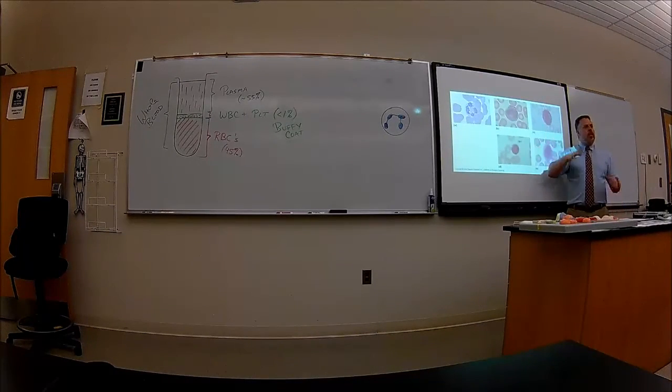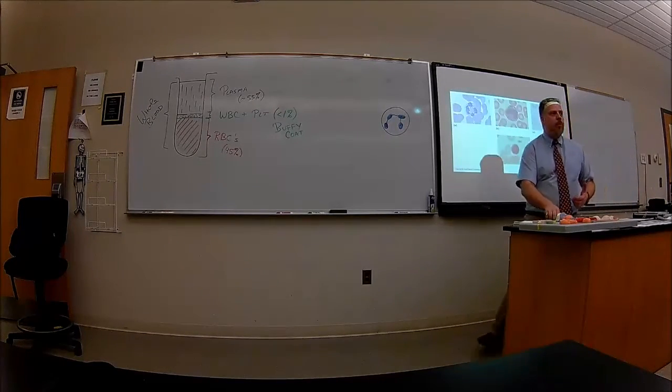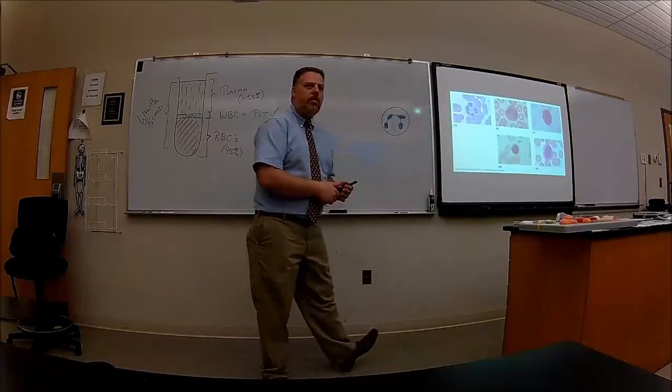Okay. Now let's just go through the motions. I know you use process of elimination. You did this already. But let's look at this one here. Is the nucleus lobed? No. It's not the best one. I would give you something different. But is the nucleus U-shaped, kidney-shaped, or is it filling up most of the cell? Kind of kidney-shaped. What can this become? Macrophage. What is this? Monocyte. Good. Not too bad, right? Okay? Not too bad? All right.